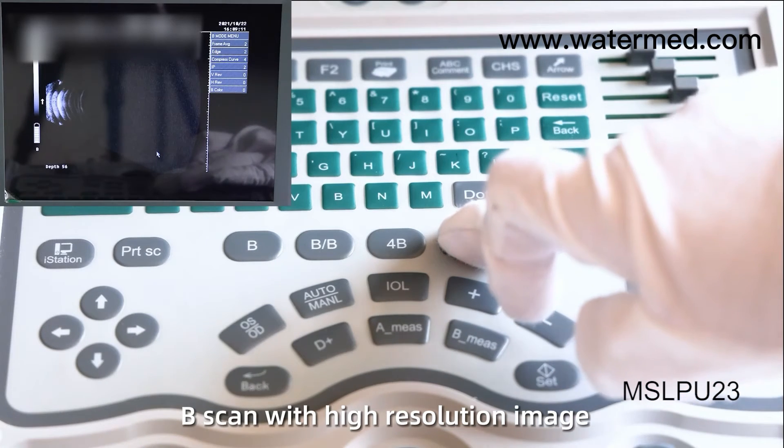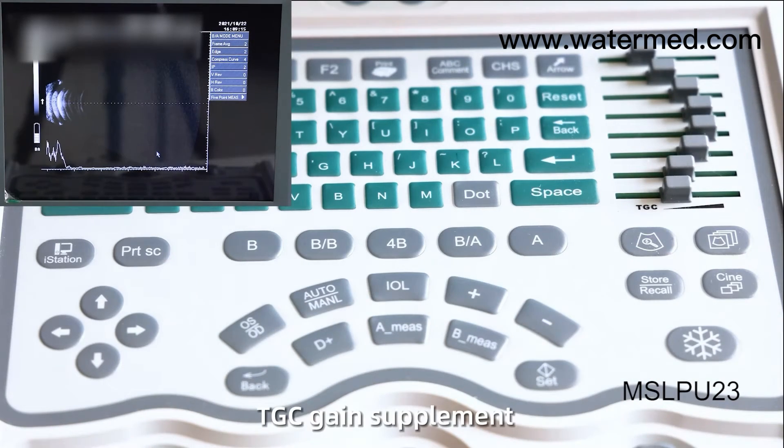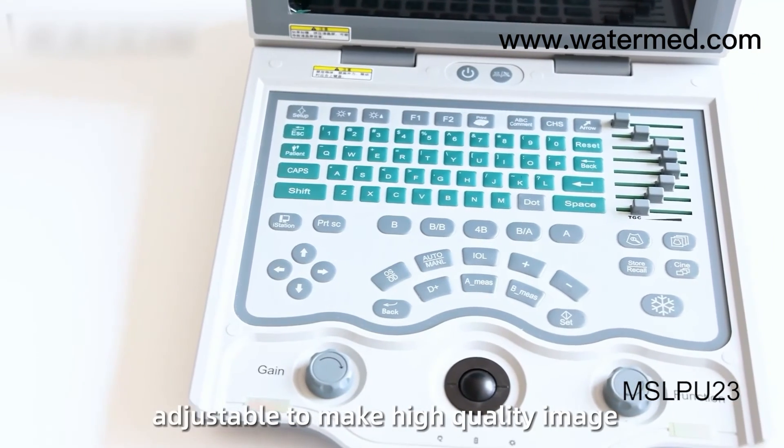B-Scan provides high-resolution images with A plus B display mode. TGC gain supplement is adjustable to produce high-quality images.